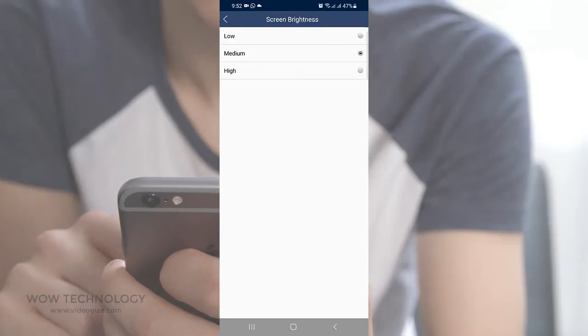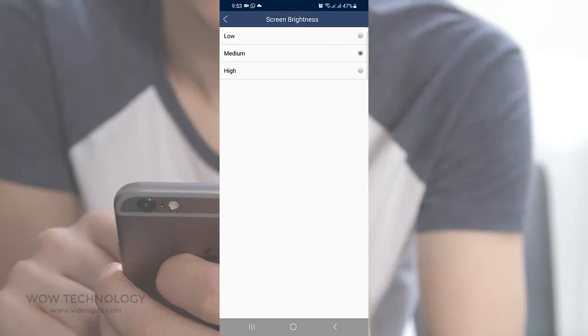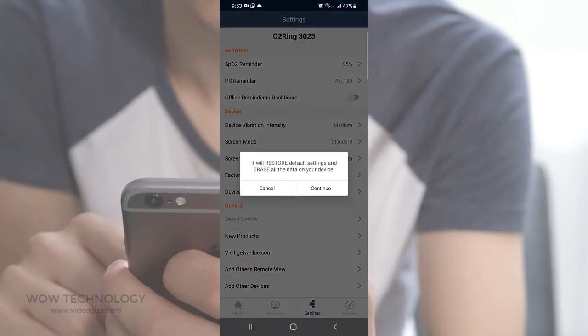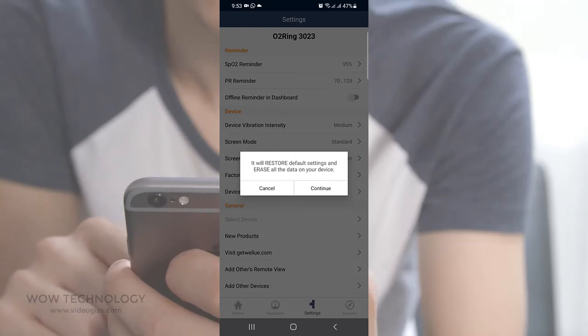You can also adjust your ring screen brightness from low to high. You can reset your data by clicking Factory Reset — remember it will remove all your previous data.